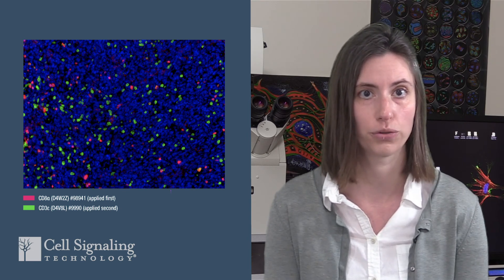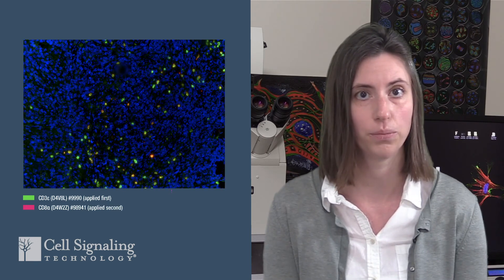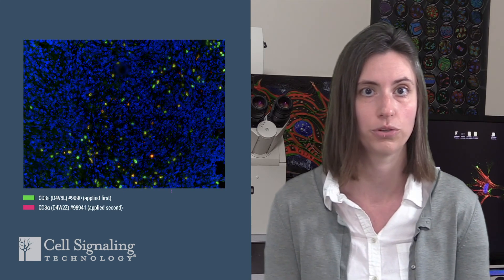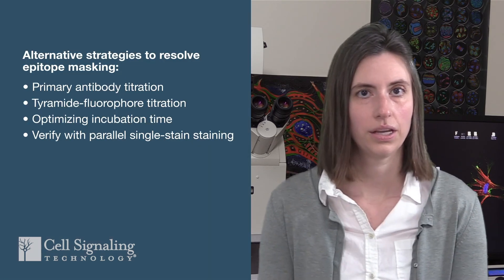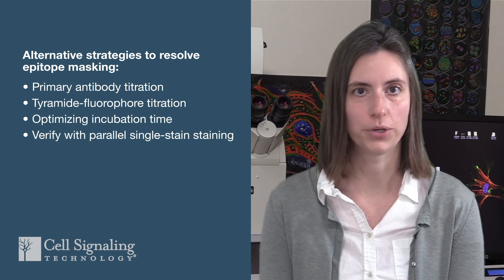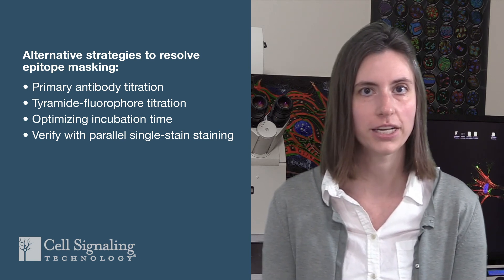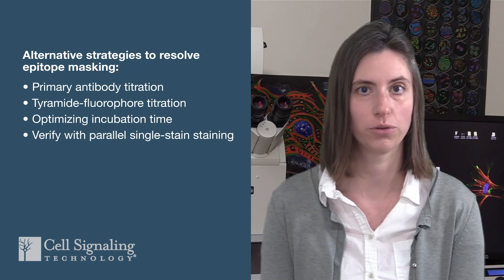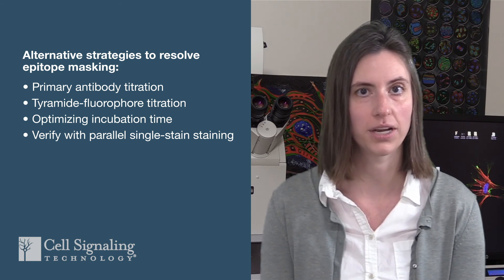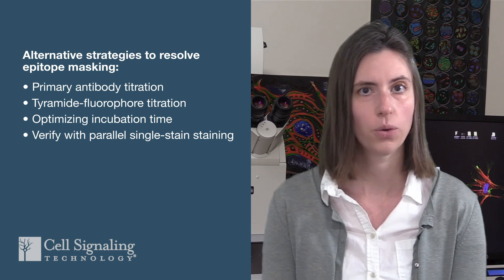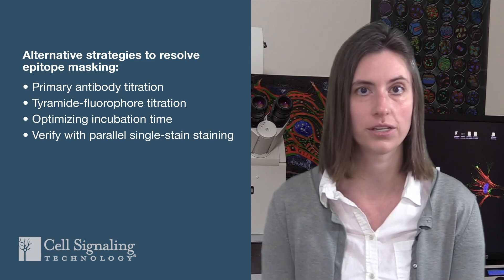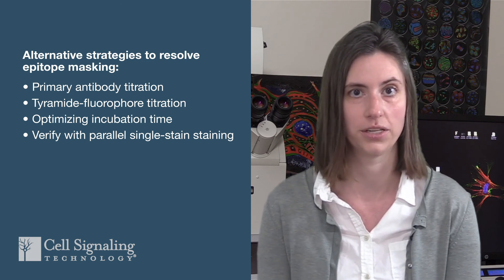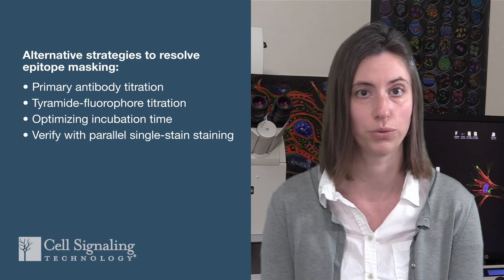One potential approach to resolve epitope masking is to switch the order of the primary antibodies. In our example, moving CD3 first in the staining order was able to restore the expected overlap between CD3 and CD8. If switching antibody order doesn't successfully resolve your epitope masking problem, you can try titration of the primary antibody, titration of the tyramide fluorophore conjugate, and/or optimizing incubation time for either or both of these. We also recommend performing single staining in parallel with the multiplex staining to ensure there aren't significant increases or decreases in the number of cells staining positively for each protein of interest.